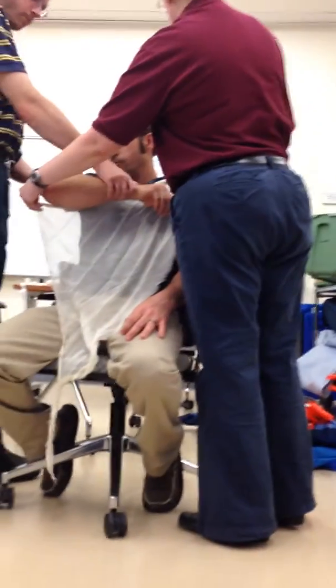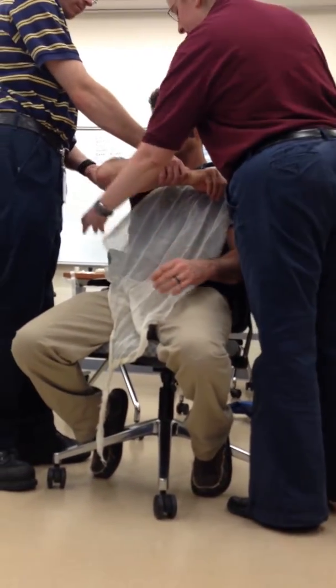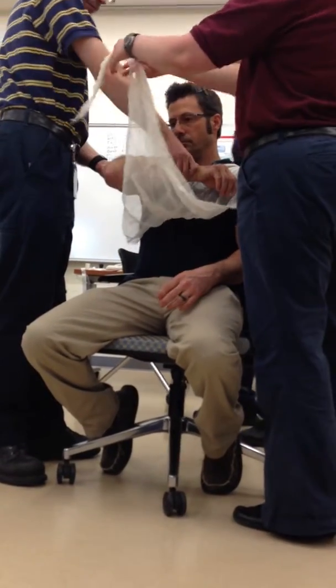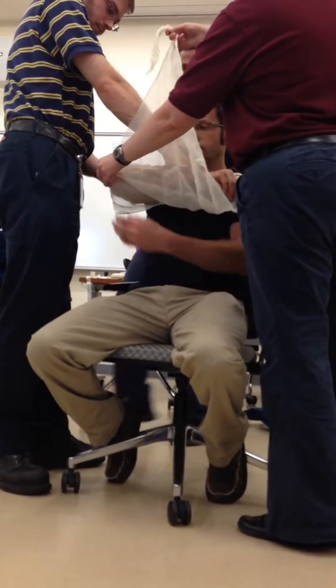The odd little point, the triangular point, goes at his elbow. You can lift up his arm for a little bit. And I'm going to lay the long point over his good arm, okay? So then the top part is going to go up over the injured arm, okay?